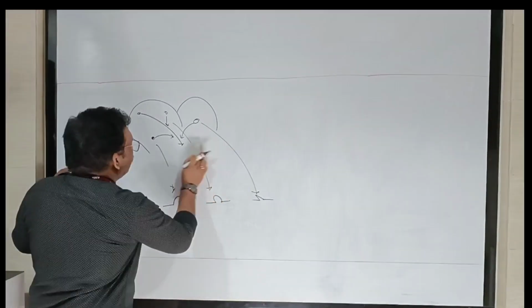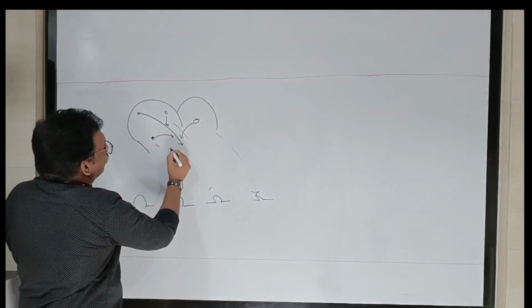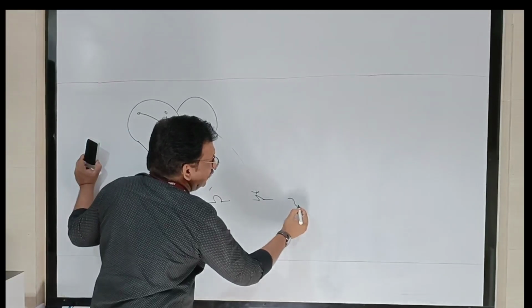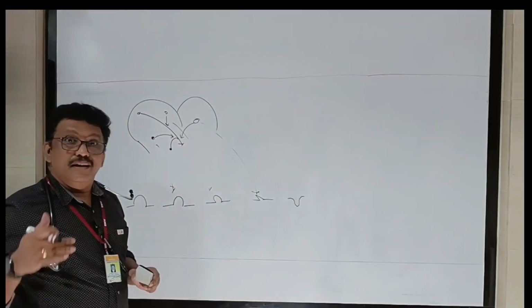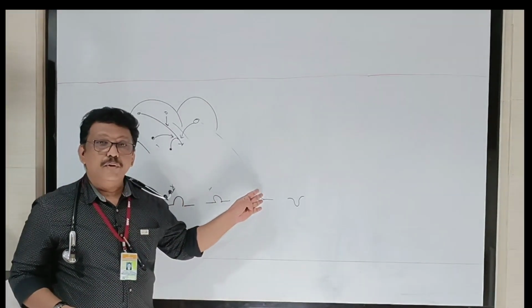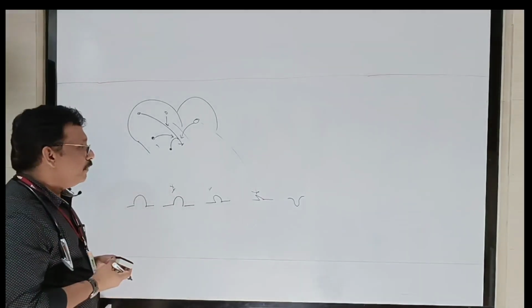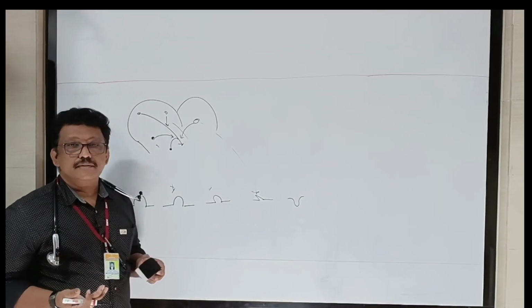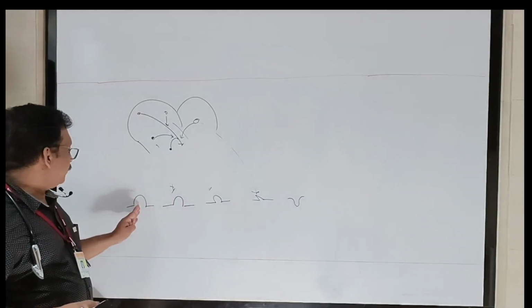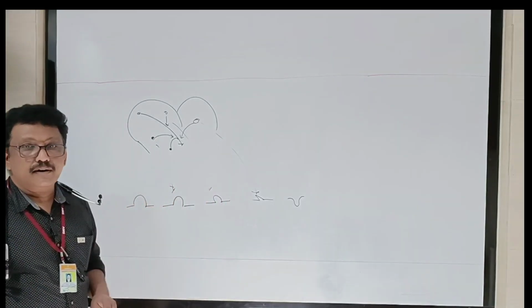And remember, if an ectopic originates from the junction and conducts backward, sometimes you can see the P wave inverted. But whatever it is, if you continuously get abnormal morphology P waves, more than 3 in a rhythm strip, you can call it a multifocal rhythm, or a wandering pacemaker. The pacemaker is wandering. So the P wave morphology is abnormal compared to the original one, but the PR interval, QRS complex, everything occurs. That is called a wandering pacemaker.